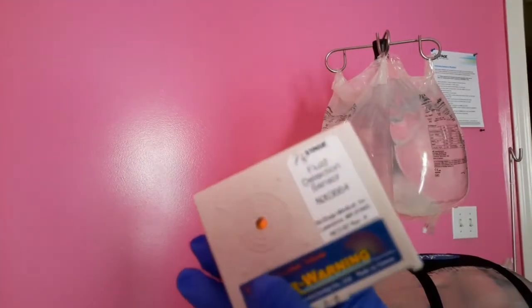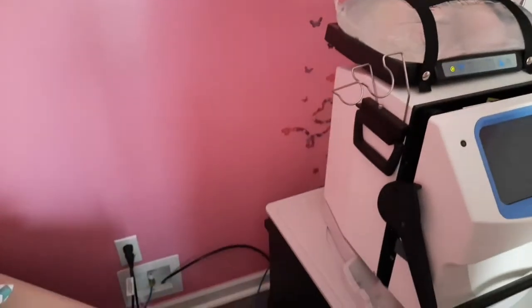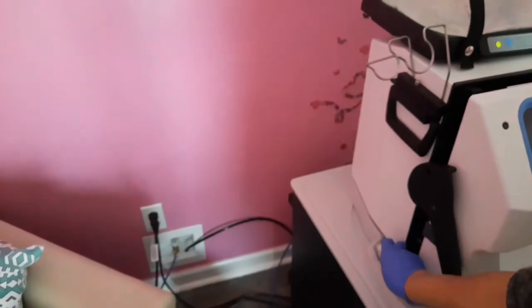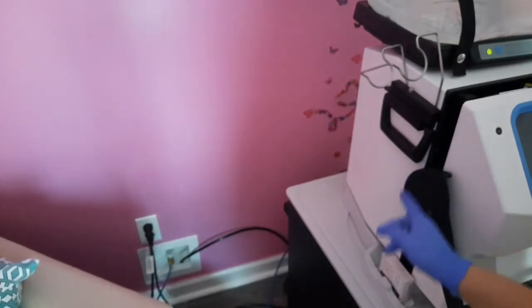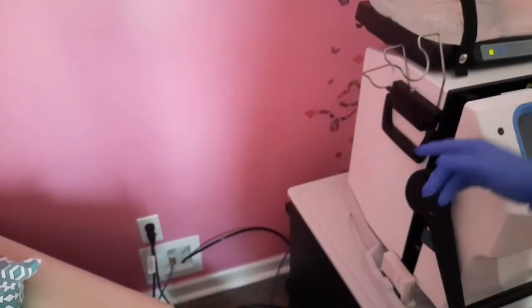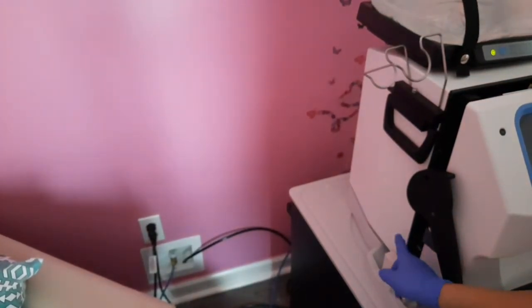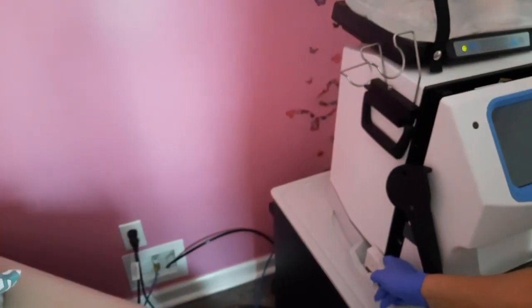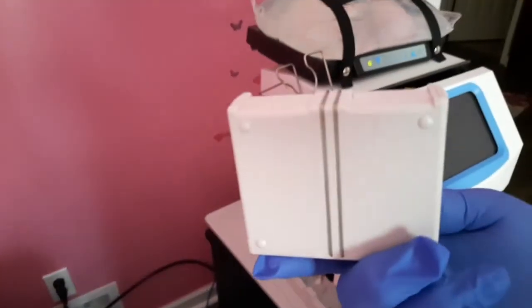Next thing is this fluid detection sensor. See it? It needs to be checked. This usually sits on the cycler right here. And what that does, it detects if there's any leaks in the cartridge where your blood is flowing through and cleansing and returning. This will alarm if there's any type of blood leak or anything. Okay? So that's why that sits there. But we have to check it every day to make sure it works.